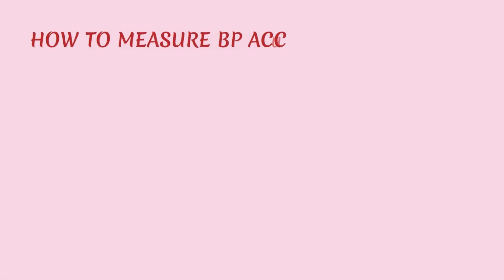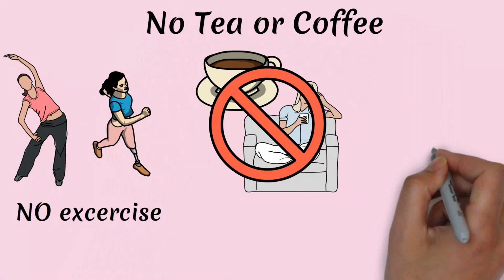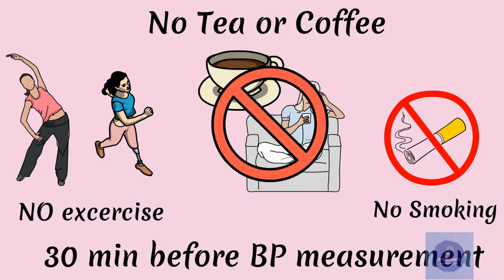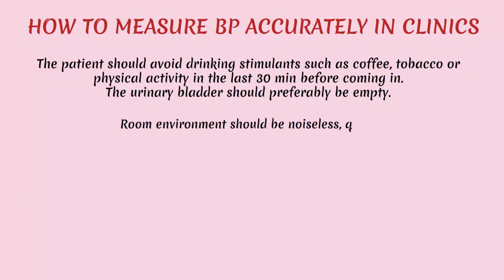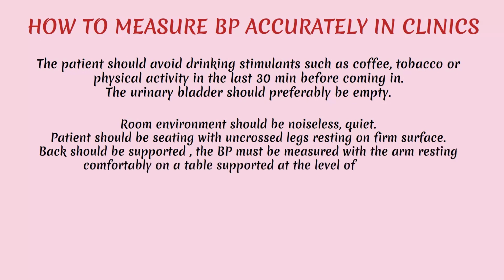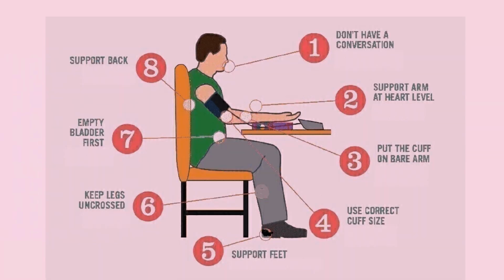How to measure BP accurately in clinic? The patient should avoid stimulants such as coffee, tobacco or physical activity in the last 30 minutes before coming in. The urinary bladder should preferably be empty. Room environment should be noiseless, quiet. Patient should be sitting with uncrossed legs, resting on firm surface. Back should be supported. The BP must be measured with the arm resting comfortably on a table, supported at the level of the heart. Various factors increasing blood pressure. In this picture, you can see all the necessary prerequisites before measuring the BP.